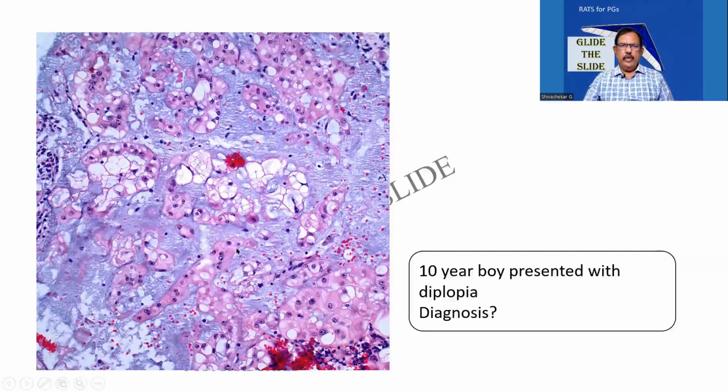In the last class, I had given you a homework on a case history with a 10-year-old boy developing diplopia, and this was the histological picture. As I had been telling you people, before ever plunging into the diagnosis whatsoever, observe.